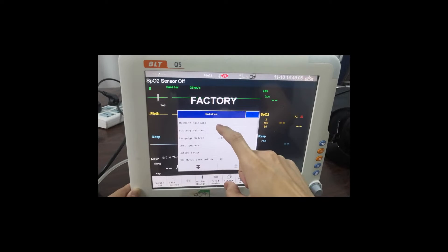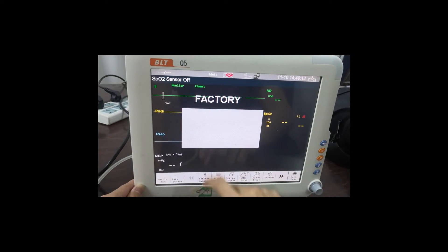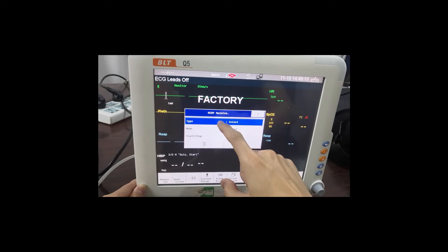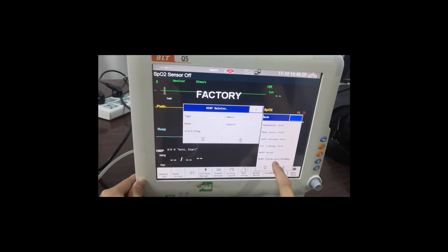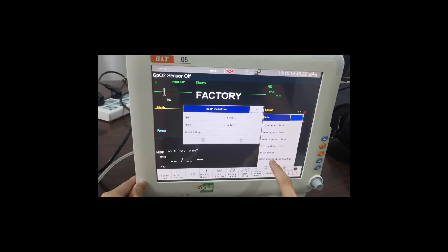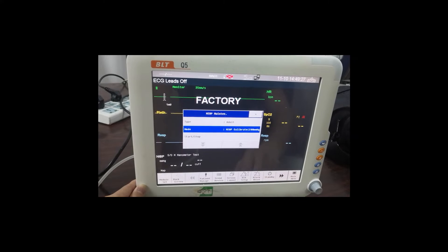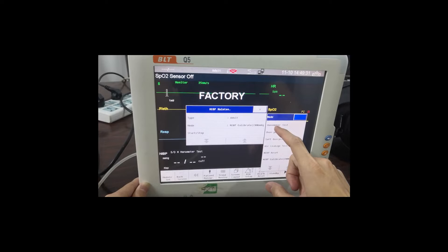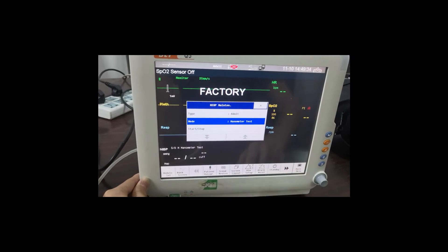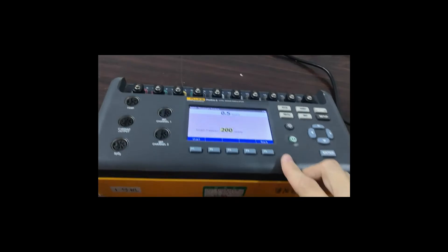Now we're going to maintain the NIBP. Here we should choose the mode — first we should set the calibrate data to 200 millimeters of mercury, and then the mode here we should have manometer test. Then we press start. Back to the simulator, we start.